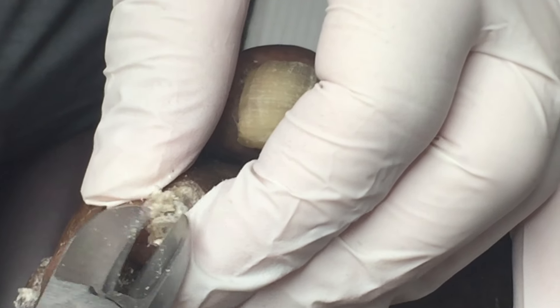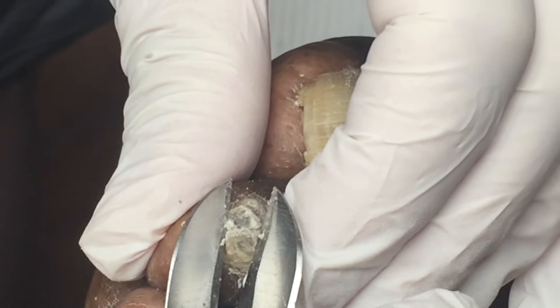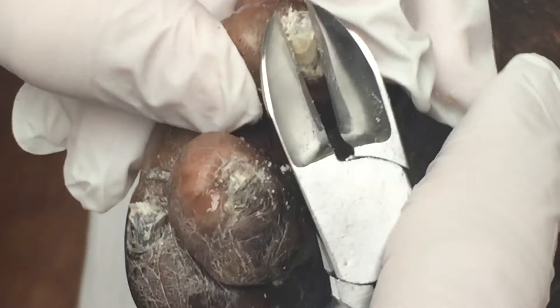This one's a little thick, but we're getting it — just chipping away at it. The key is to take as many small bites as possible so that it's not hurting the patient. Let me know, okay? I'm trying to be extra gentle.